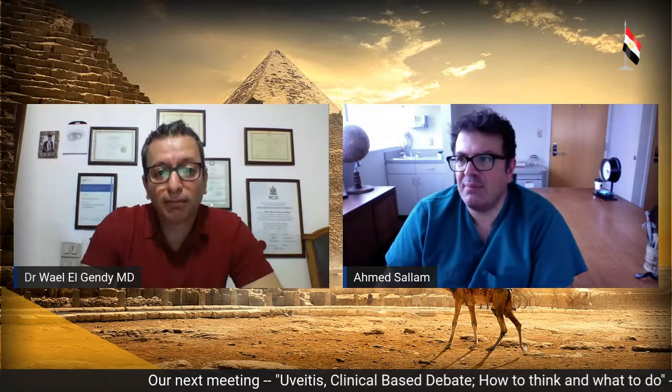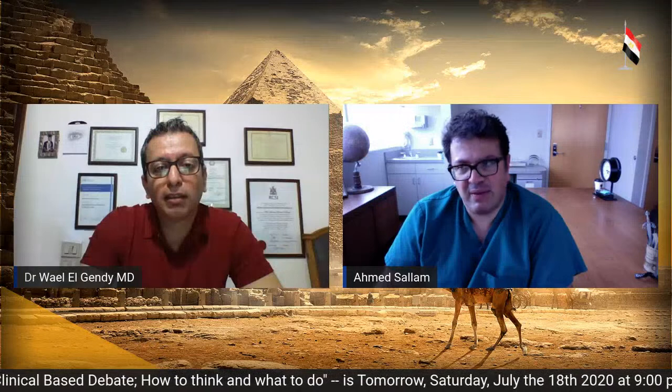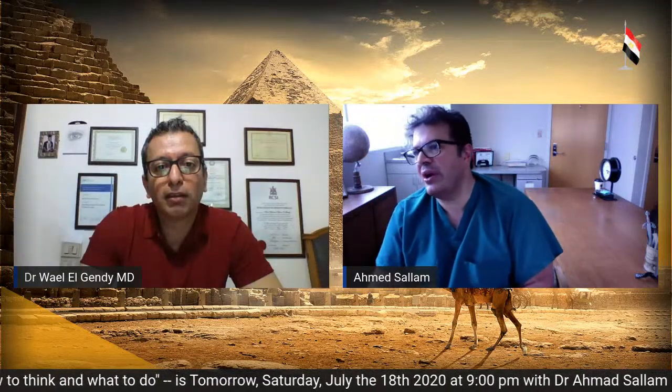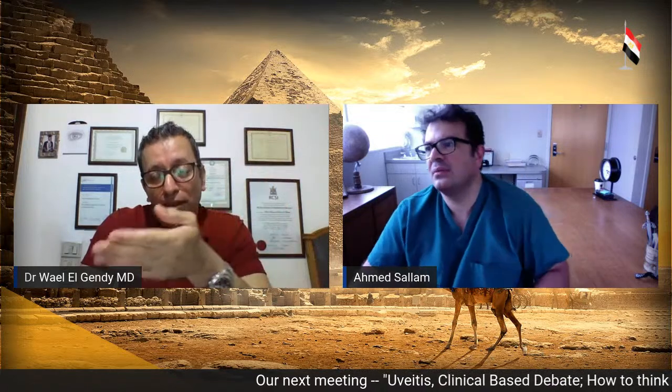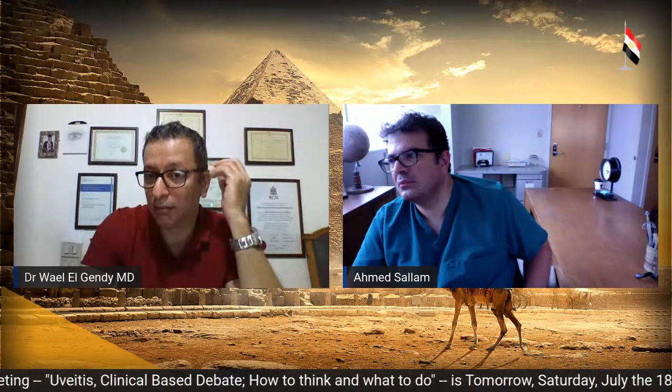Would you buckle the other eye? We answered this question before, right? Yeah, I would not, but I think a buckle on the other eye, as you said, is radical, but I feel it's better than laser or cryo, because the problem with prophylactic laser, and this patient I'm telling you about, 19 tears, is you get the tears on the edge of the laser, and then the tears become posterior, and they are more difficult to manage. Exactly. We just said that one of the high risks is the cryo and the laser itself.